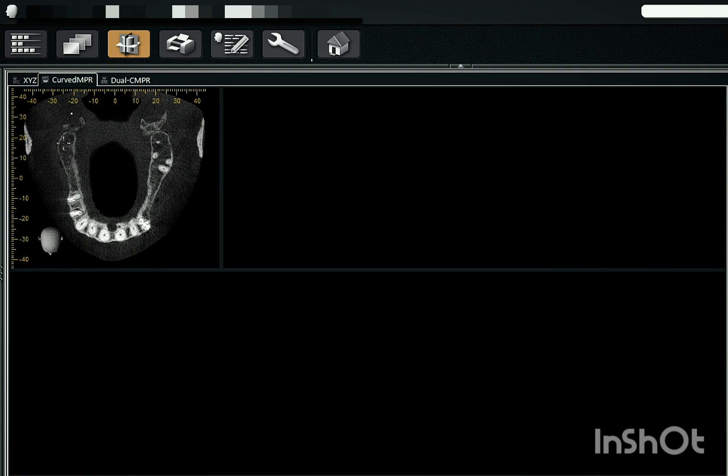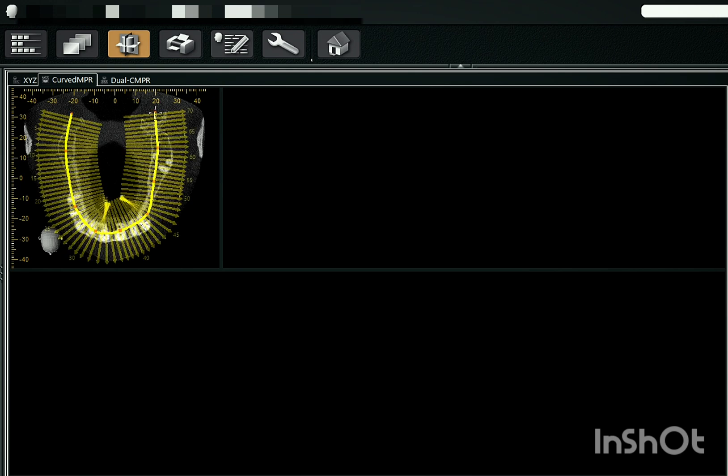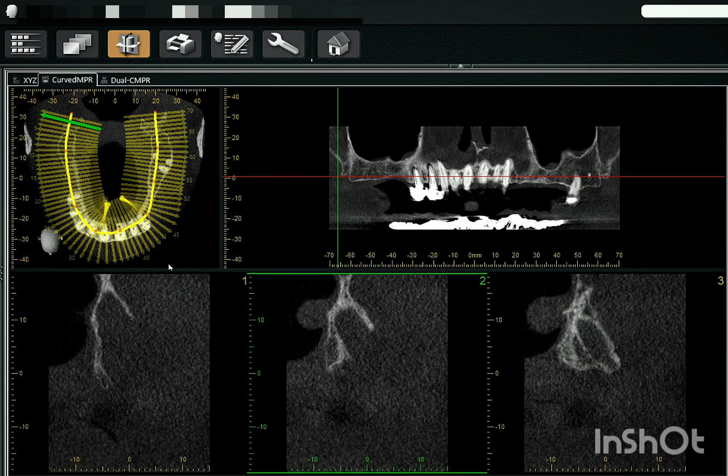So first we'll do the arch marking. This is the basic arch marking for 10 by 5 FOV maxilla, medium FOV maxilla.